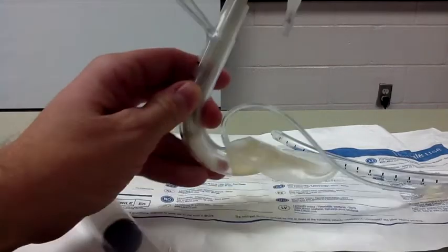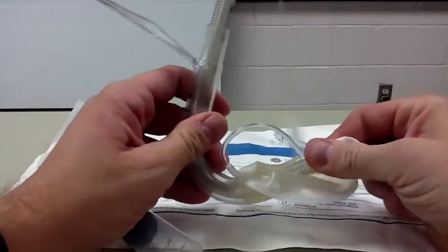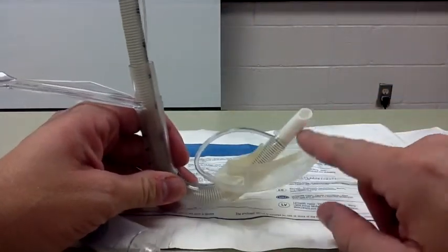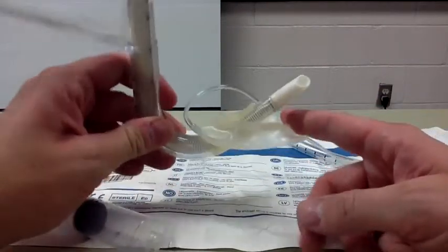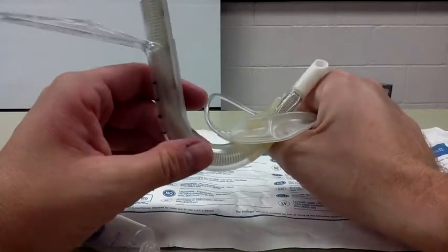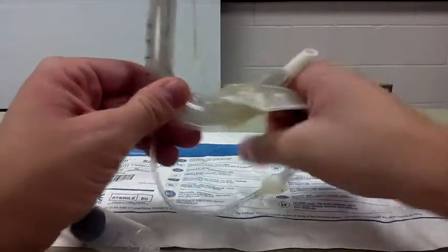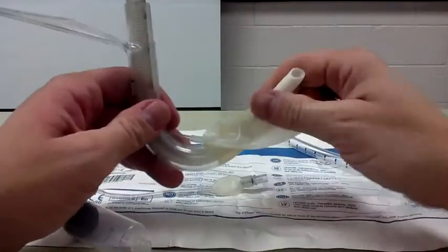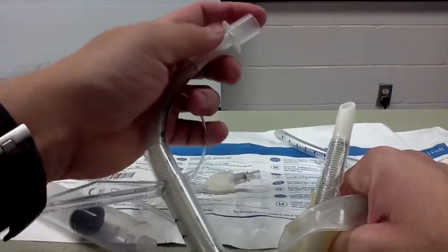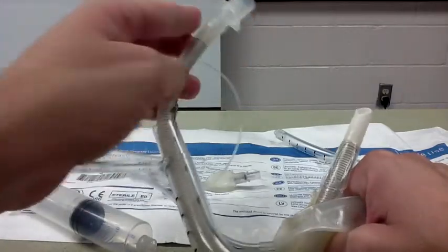The endotracheal tube can be inserted blindly into the LMA and is guided into the glottic aperture. In theory, the esophagus will be somewhat obturated by the distal tip of the LMA, and the endotracheal tube will then pass blindly into the glottis. You can then ventilate the patient through the proximal end of the endotracheal tube.